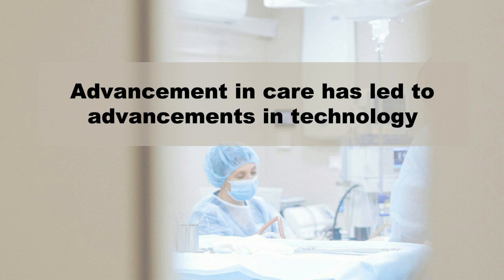When facilities are looking to build a successful structural heart program, the setup will often evolve into a hybrid OR suite. A hybrid operating room is an advanced procedural space that combines a traditional operating room with an image-guided interventional suite. Specific days could be dedicated for structural heart procedures, and other procedures, such as cath and peripheral, could be performed in the same room to utilize the technology on the off days.